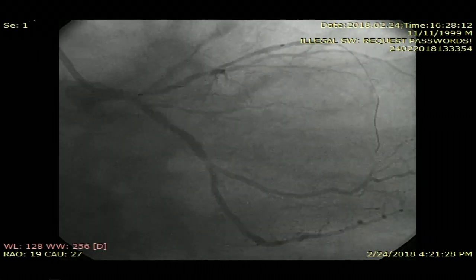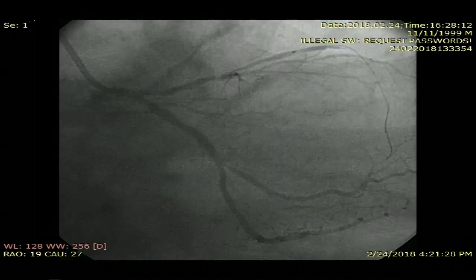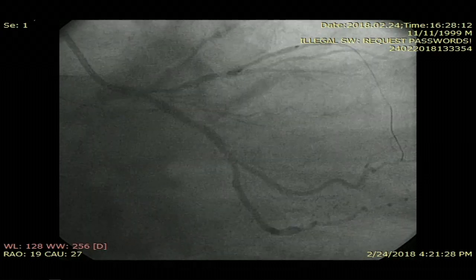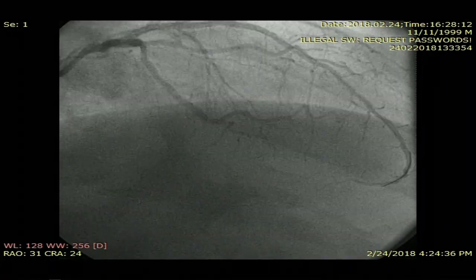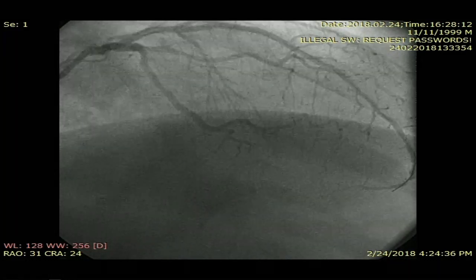We didn't protrude into the left main because we had a landing zone where it was possible to put the stent. Then we inflated the stent at this position, and that was the final result of the LAD with no problems and TIMI-3 flow.